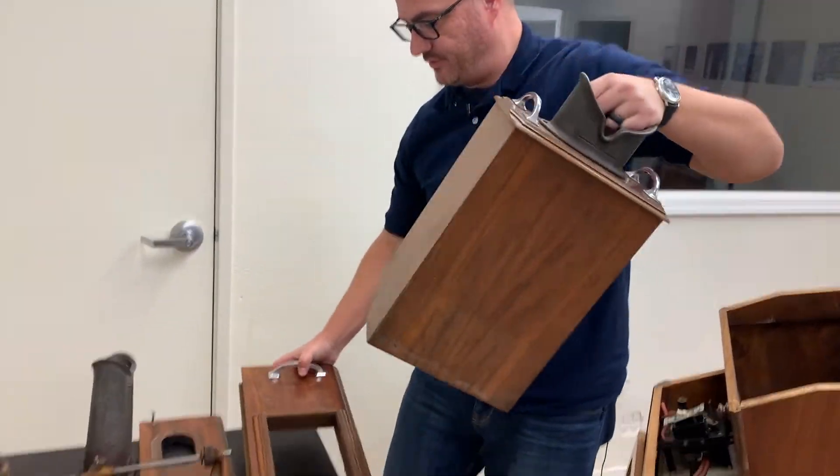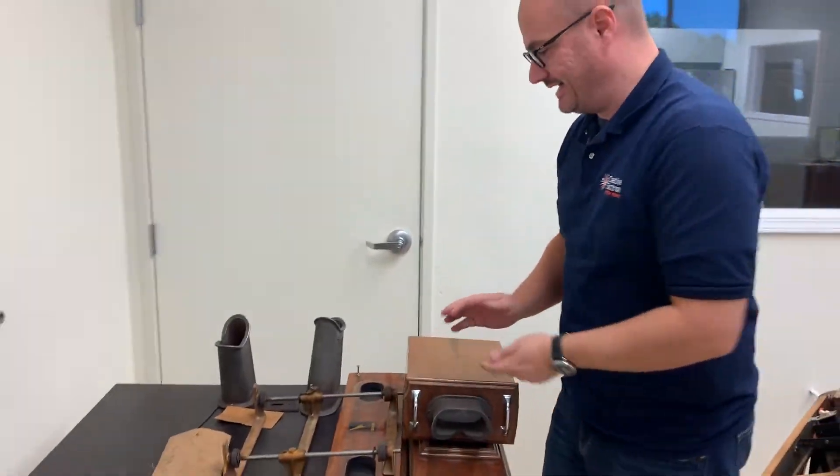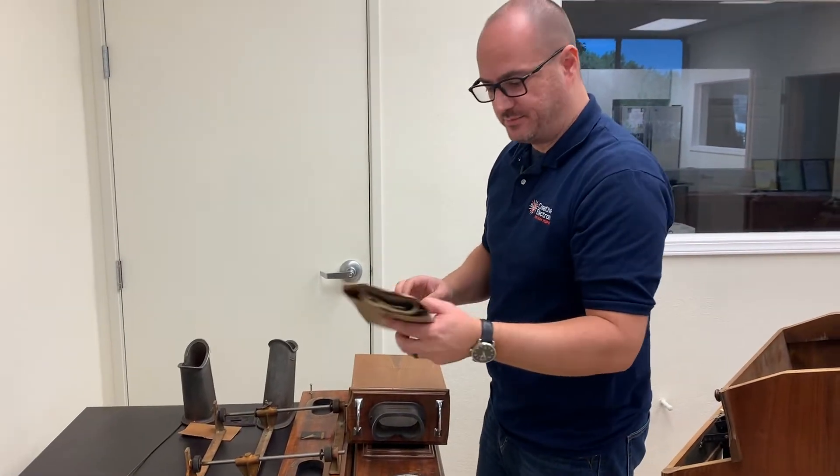Beautifully made, beautifully executed. What was really curious about this unit is that it came with the original paperwork that was delivered with the machine.